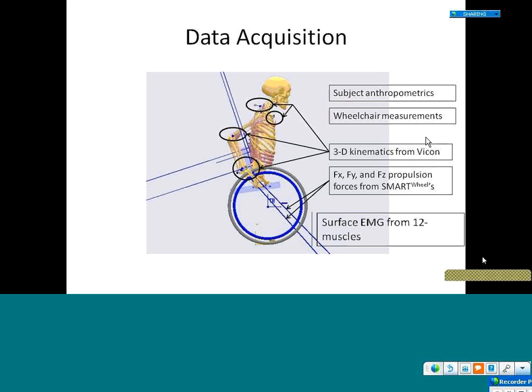All of the data that I'm going to be showing today, I'm only looking at the contact time of the push stroke, so I'm not looking at any recovery. I'm only looking at the hand-on to hand-off part of the propulsion.